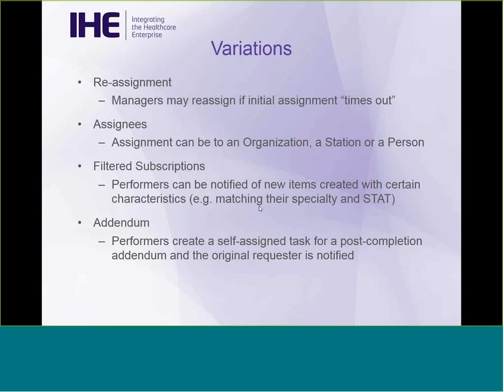So for example, a particular radiology practice might set up a filter for their particular specialty and for stat, high priority exams, so that when something is posted to the open work list, they would get a notification that there's something there that matches their capabilities, so they can go take a look and decide if they want to claim it. Handling addendums is also discussed in the profile.